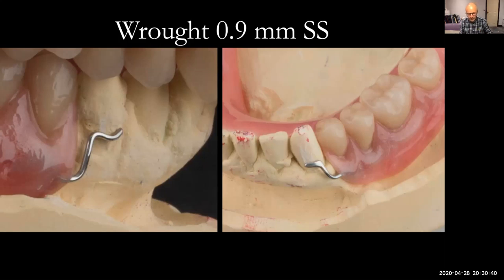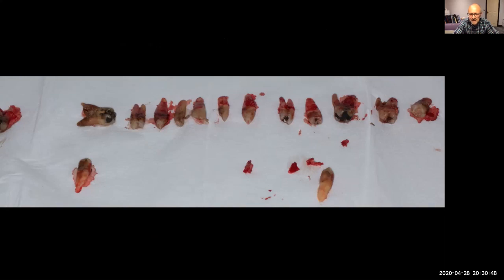So let's now fast forward to treatment visit 2, which is when Joe is going to have the teeth out. So we take the teeth out. I don't like this phase, actually. It's not very nice, numbing them up and taking them all out.